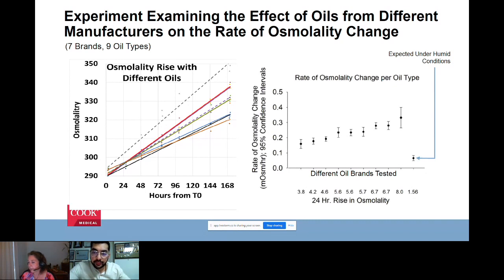Okay. And the best way to equilibrate oil would be the same as the way that you would equilibrate your media, so overnight. But in a dry environment, all of the water that will have been absorbed by the oil will evaporate, because oil still absorbs a little bit of water. And remember also that even through dishes, there's actually an evaporation as well. Perfect. Thank you.